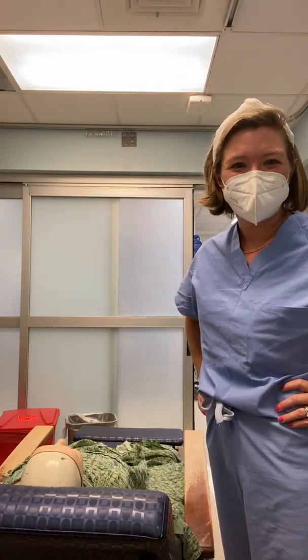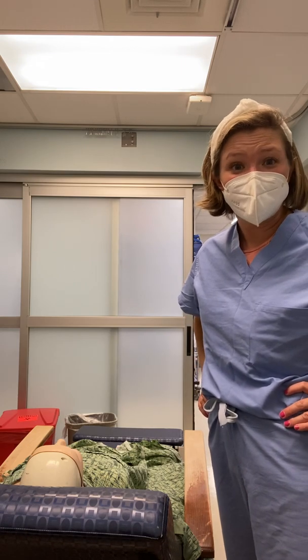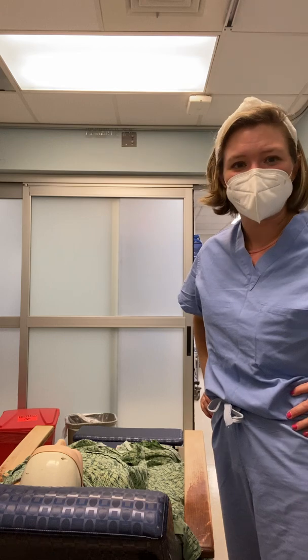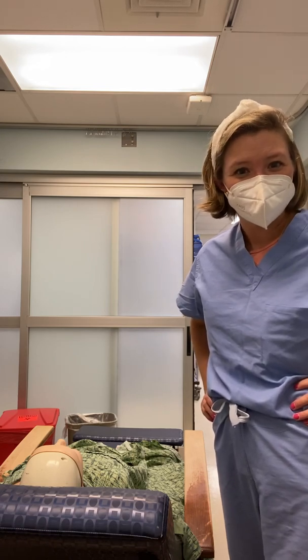Hi, and welcome to part 1 in our series of demonstrations where we show the block nurse how to prepare, assist during, and recover a patient for a catheter insertion procedure for the use of an On-Q pump. Part 1 reviews how the nurse sets up the space for the patient prior to the patient's arrival.